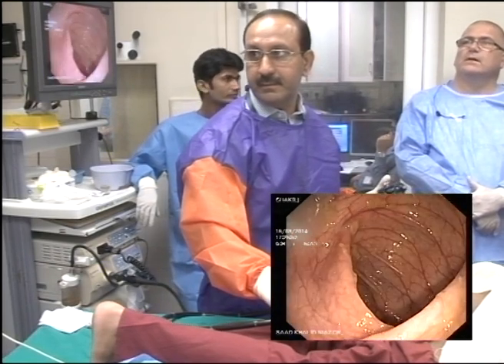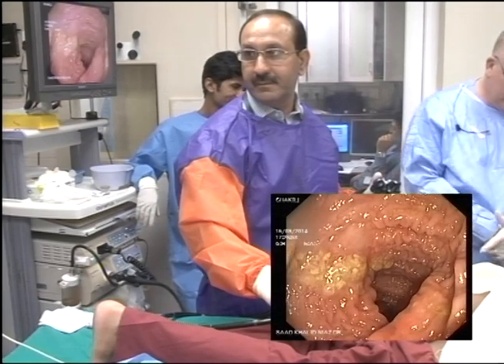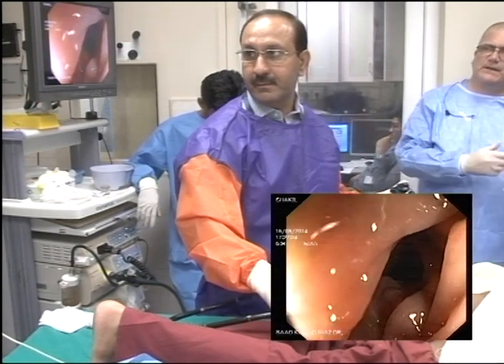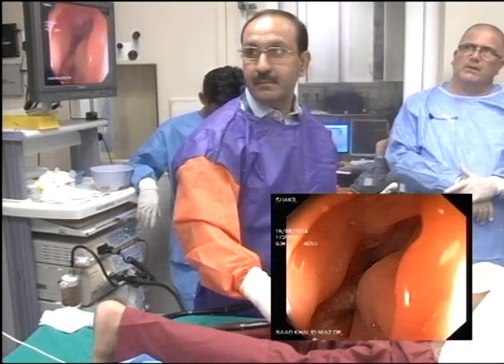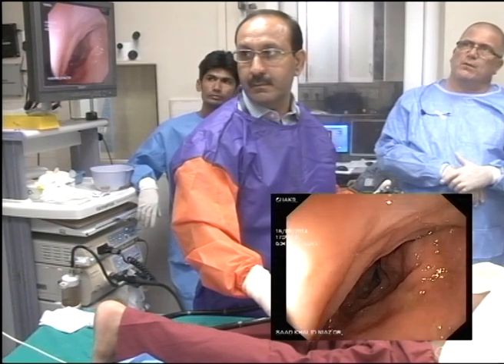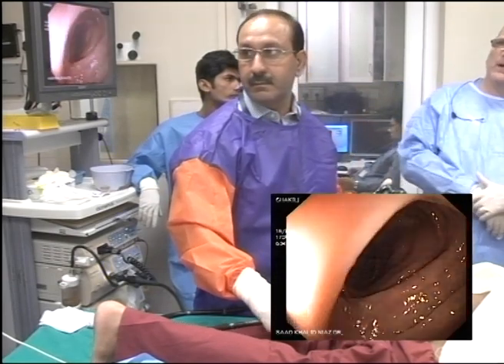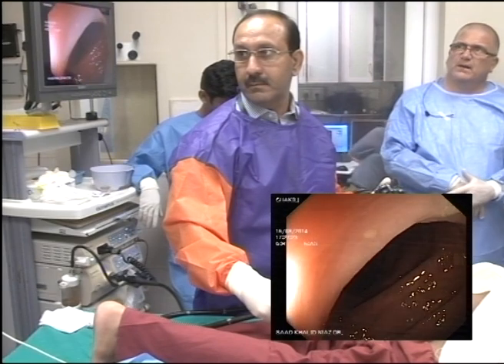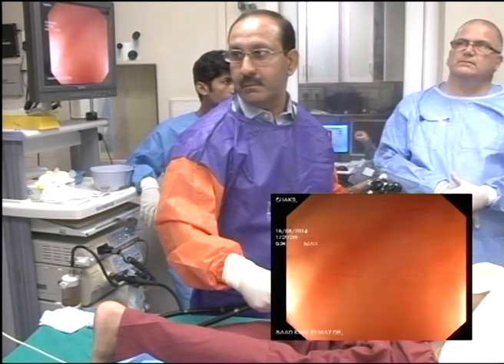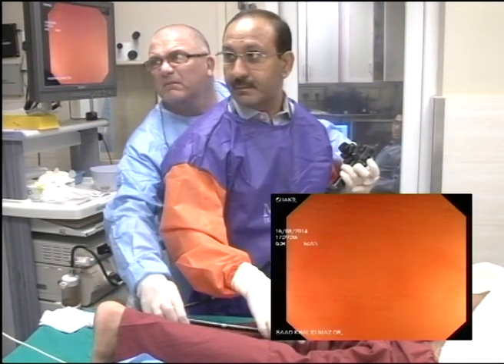Suck. Keep going. Wonderful. Now what would have happened there, Saad, back in the UK with a lot of guys? They would have taken the scope right back to the rectum and started again. I personally feel that when I have a trainee with me, I like to show them they could have completed the test from where they got completely stuck. We didn't take the scope back, but I had to try all sorts of things to get it round. We had that discussion, Paul, as I am one of those who might have done what your other colleagues do. But I was just admiring your skills and your patience both.